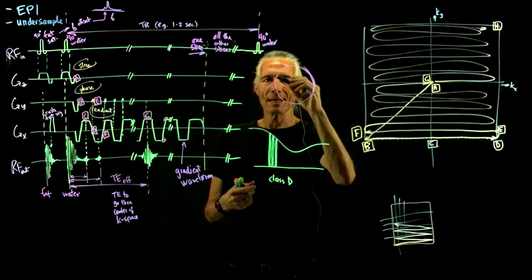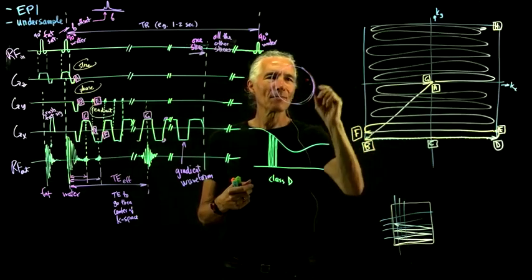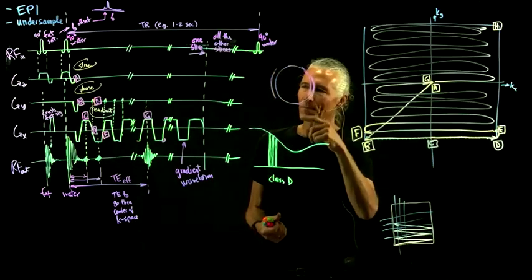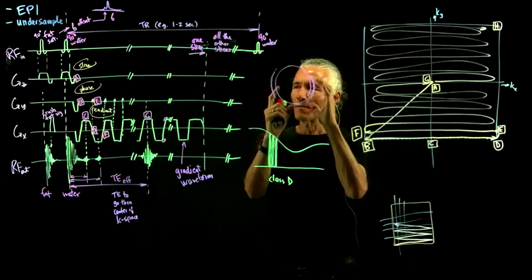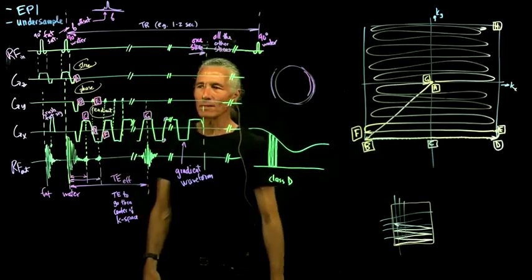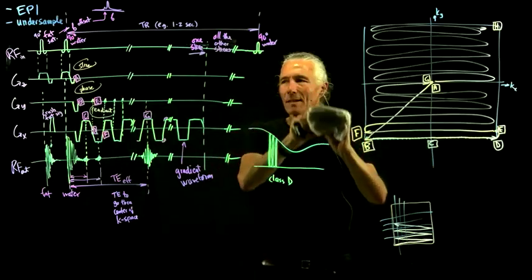And what will happen, like I said, on one side it'll be okay, the fat will be sitting out in the air like that, but on the other side the fat is going to be moved inside the brain, like a little white stripe inside the brain, and then really mess it up. You can just tick it off on the EPI and suddenly you'll see the fat get brighter, and then you'll get this little ghost. But it's often used in other sequences, so it's not just this one, but it's almost virtually always on here, just because we're almost always recording the brain.